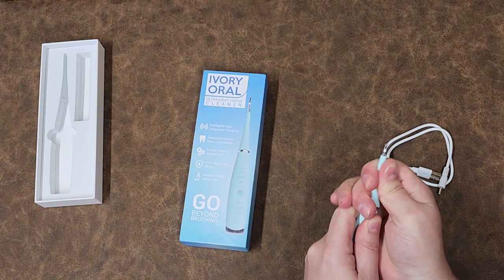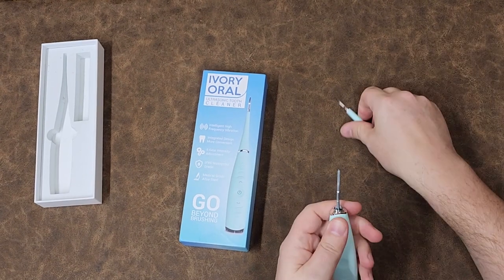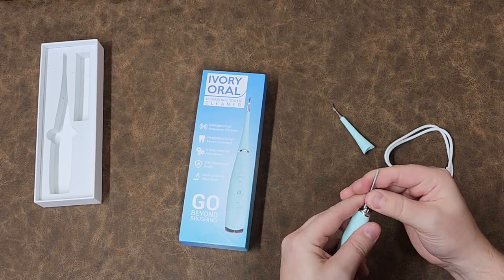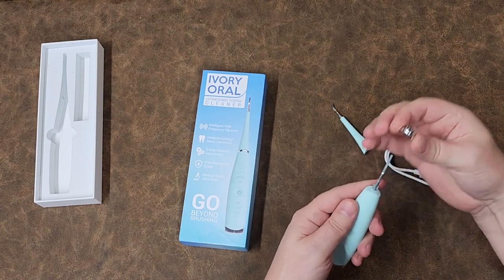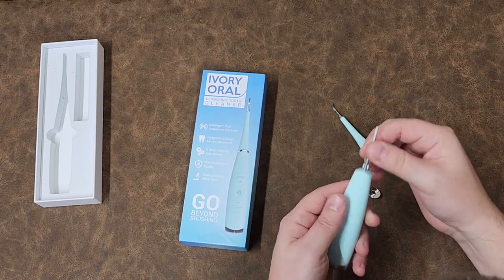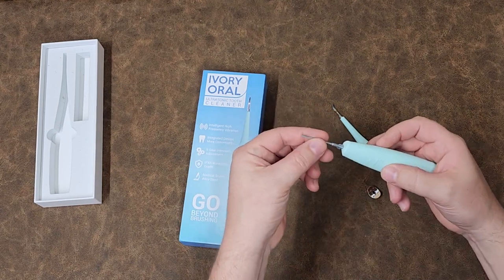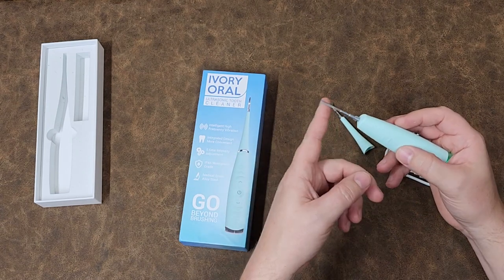I was able to just pull the tip off, so here you can see it's a very soft pop metal that goes down there. It's clearly very soft — I'd say this is maybe even good for a lock pick or something. It's wild that that's what they came up with.